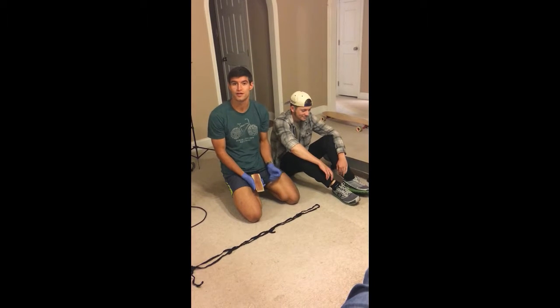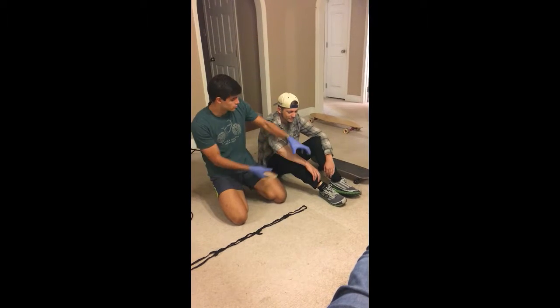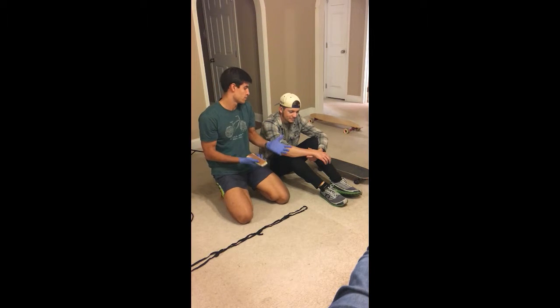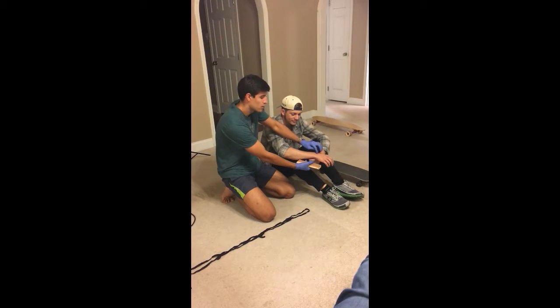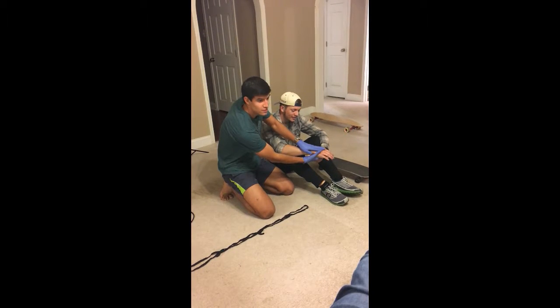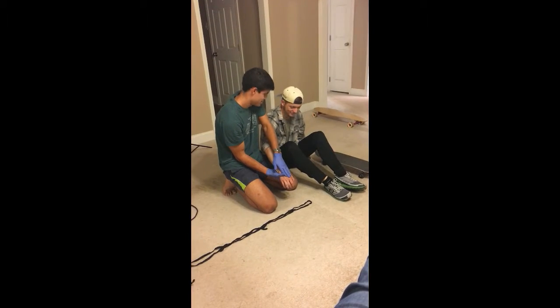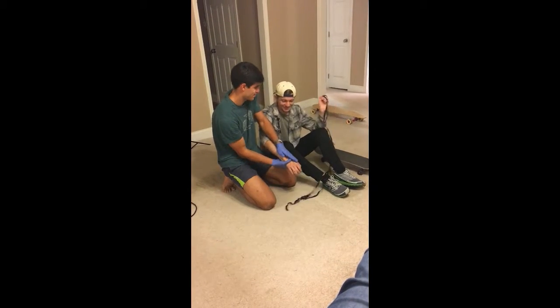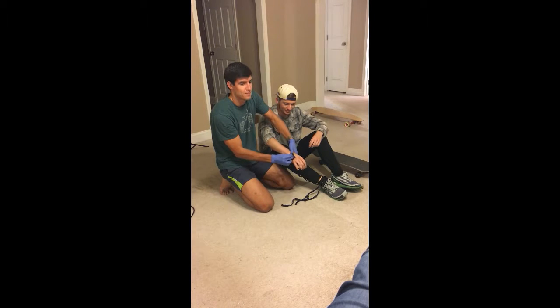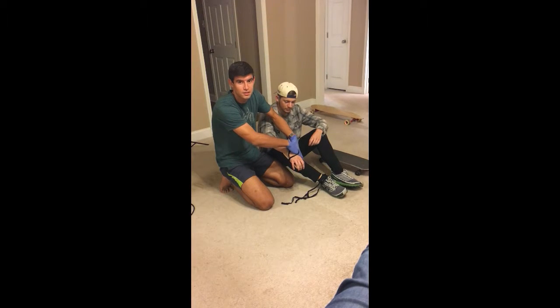Throughout this process, we need to use the acronym CSM, which stands for Circulation, Sensation, and Movement. Now that we know there's an injury on his wrist, we need to make sure we don't move it too much. We're going to feel it out to see what parts hurt. Right around here, if you touch it, it starts to hurt. What we're going to do is incapacitate it by putting this piece of wood on it. From there, we're going to grab this rope and wrap it around the piece of wood. This is going to help make sure it doesn't come out of place. And if it gets worse throughout the night, we're going to see a doctor in the morning.